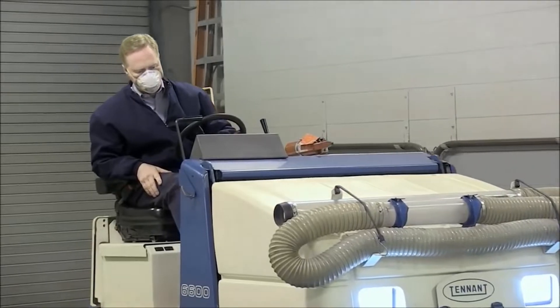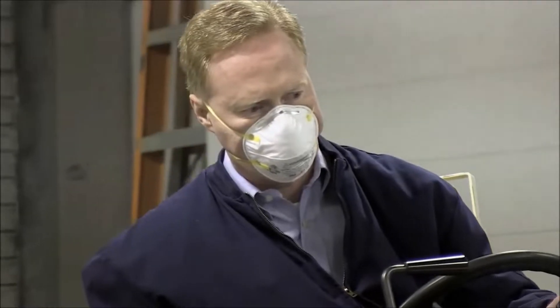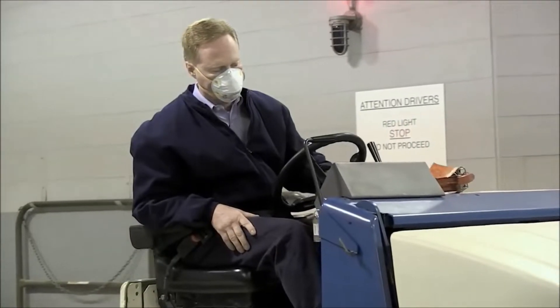N95 respirators block at least 95% of hazardous dust and other very small particles that employees may be exposed to during their work.